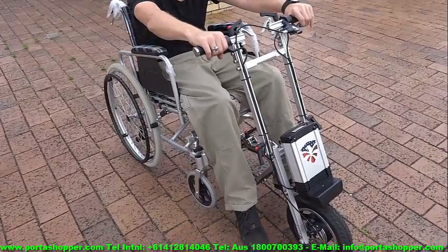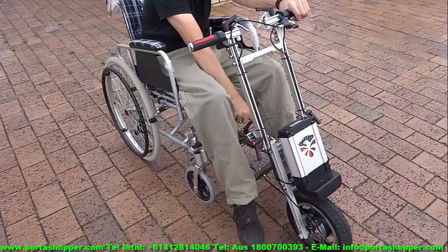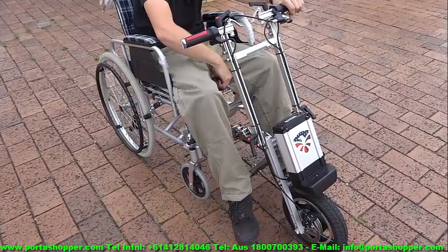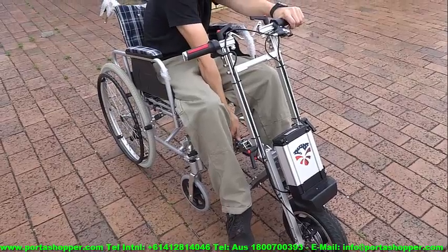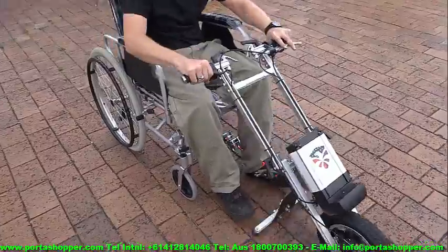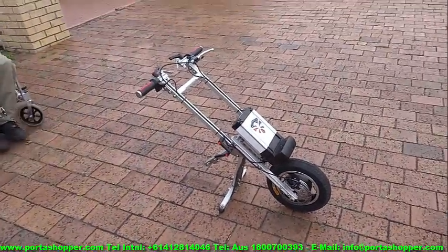Engage the wheelchair brakes again and reverse for an inch or two just to relieve the tension on the tow hitch, and then remove the safety bolt by twirling it anti-clockwise. While keeping the Portawheel brakes engaged, just lift the unlock lever and then you can let go of the brakes. Set it to forward then and use the throttle to move it forward and out of the way.